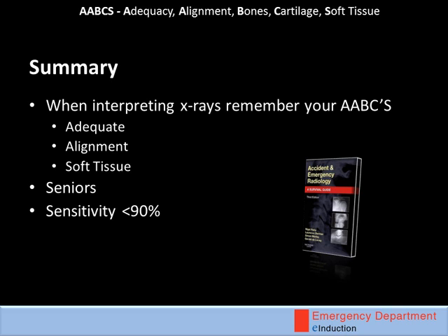You're going to remember to draw your 4 alignment lines on the lateral view, and your lateral alignment lines on the PEG view. And you're going to think about soft tissues on that lateral view. As with everything in the emergency department, if you've got concerns, just ask. There'll always be a consultant or a registrar on the shop floor who will be experienced in looking after patients with potential C-spine injuries. As I mentioned in the previous module, normal, adequate X-rays can still miss significant unstable injuries. So if there's any concerns with your patients, this would be a great reason to talk to them.